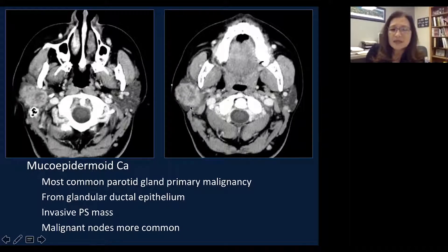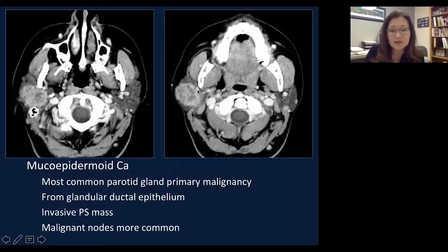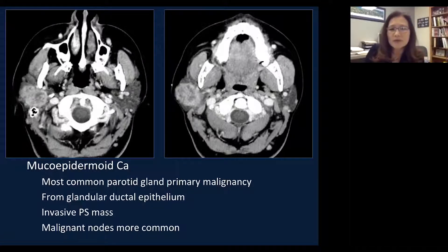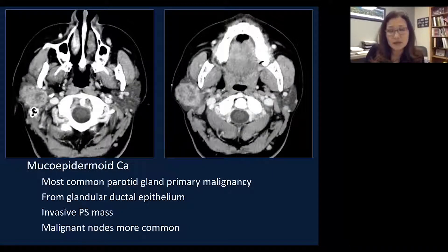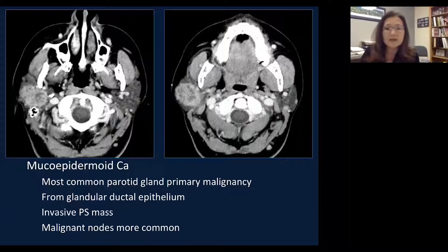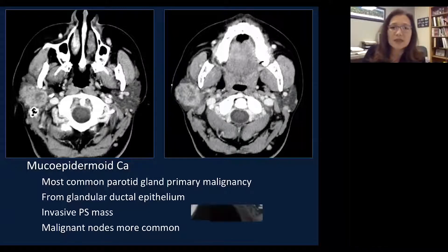This tumor is inside the parotid gland and not violating the parotid gland capsule, but it can be very infiltrated. Mucoepidermoid carcinoma is also associated with lymph node metastasis. Not many other parotid gland malignancies have lymph node metastasis, but mucoepidermoid carcinoma does.